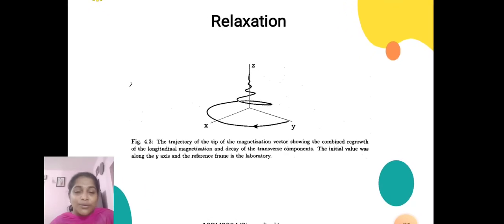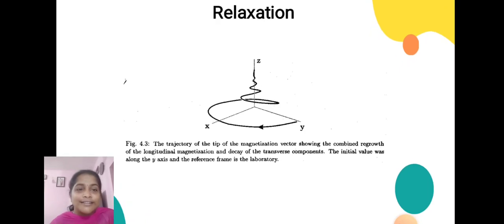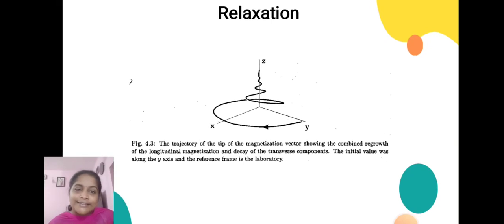And after all the process, the system will go into relaxation. See here how it looks in the relaxation stage. As already mentioned, it is not fully ideal, but it has some amount of magnetic field.